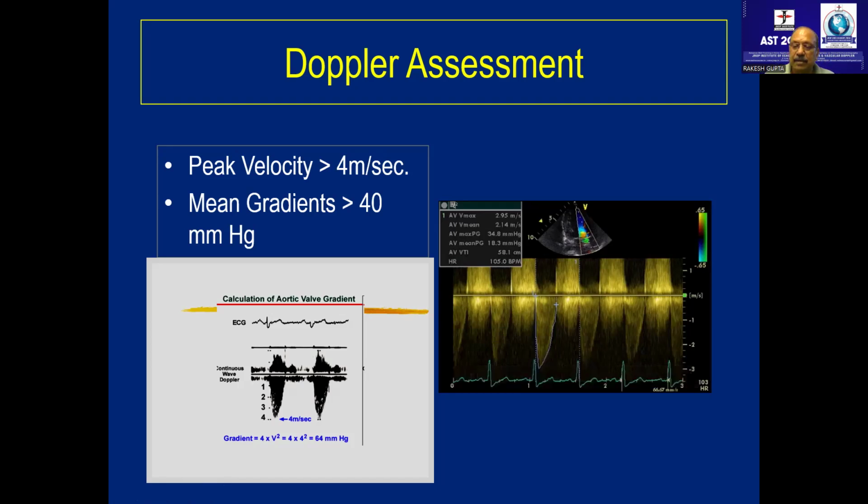Yes, sir. So once you look at the Doppler flow pattern by continuous wave, it means you are looking for velocity across LVOT, aortic valve, through and through all segments across this line. And this aortic valve velocity, you trace this aortic velocity, peak velocity is more than 4. If you trace this mean velocity, mean gradient more than 40 millimeters of mercury, and whatever you get a velocity time integral, look, it's 58.